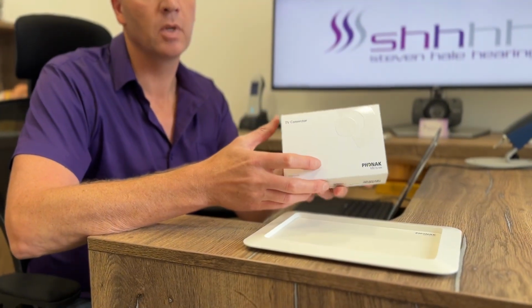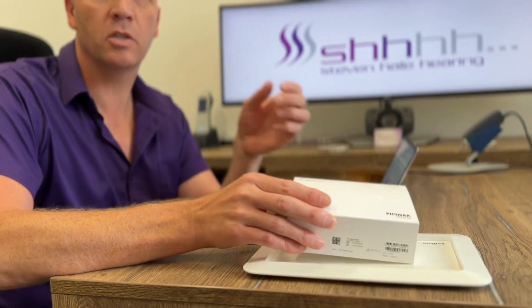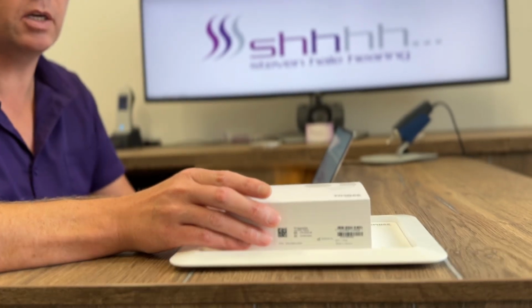Okay, so we're going to show you about the TV connector. If you're not sure what a TV connector is, your hearing aids are Bluetooth enabled, so we can connect them to several different devices, one of which being the TV connector. This essentially turns your TV into a fully Bluetooth enabled TV and will connect directly through your hearing aids. So let's show you what's in the box and how to connect it to get the most out of it.